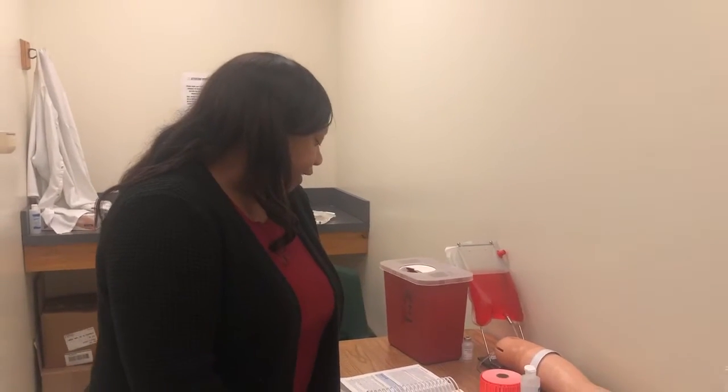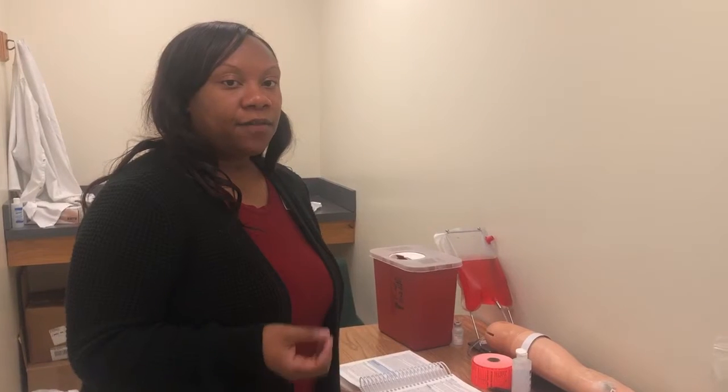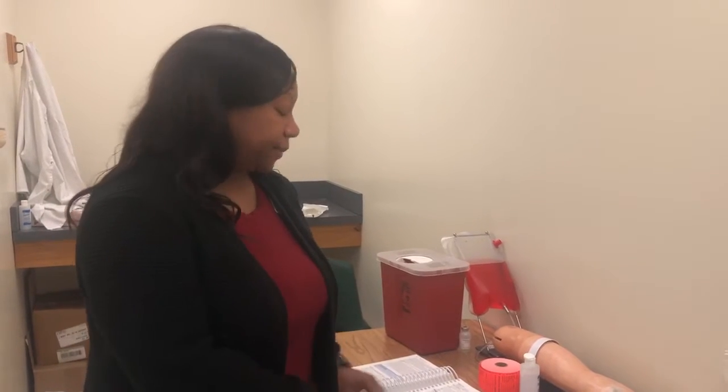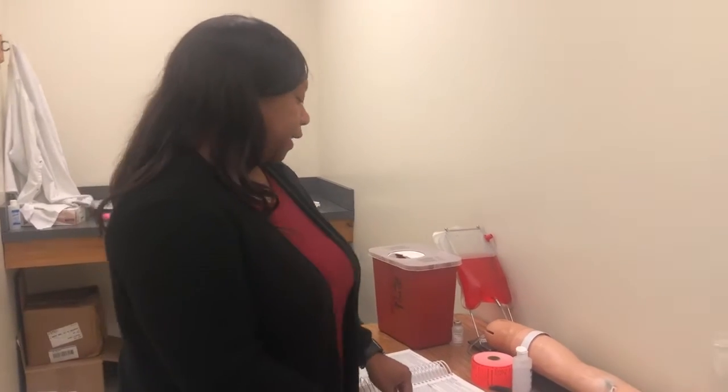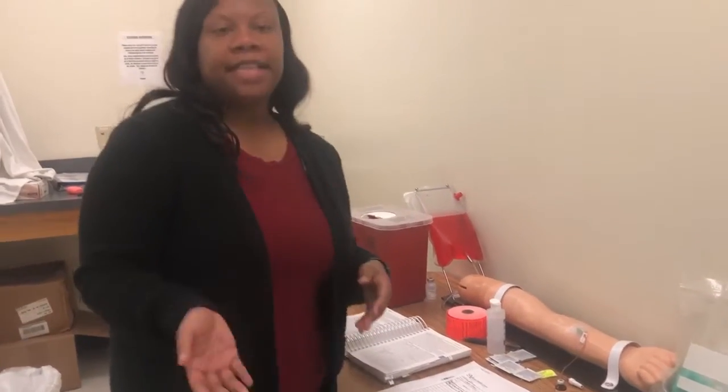My rate of administration will be 40 milligrams or a fraction, and it can be given over 1 to 2 minutes. So I'm giving 30 milligrams, which is within that range. Also, I'll be monitoring potassium, as it's a loop diuretic, so it'll be pulling some fluid off Miss Green. So I'll be really monitoring her electrolytes and getting her vital signs.